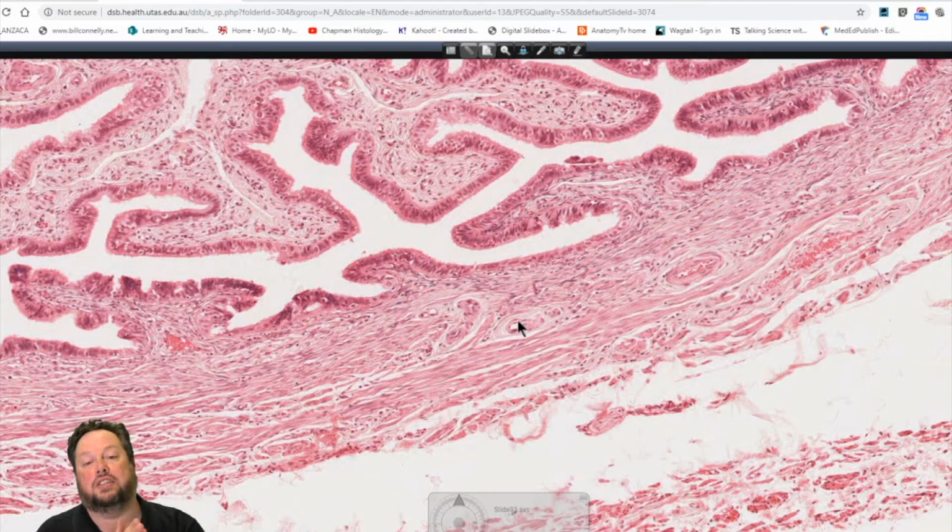As we move along towards the uterus, we get several changes happening within the structure of the uterine tube. I don't have multiple sections of the different regions of the uterine tube, I've just got this one. But the folding of the mucosa decreases as you move closer to the uterus, and the thickness of the tunica muscularis increases. It starts off as a relatively thin muscular wall in the ampulla, and becomes thicker closer to the uterus. That makes sense, as it's going to eventually become continuous with the uterus, which has a very well developed muscle layer in the form of the myometrium.